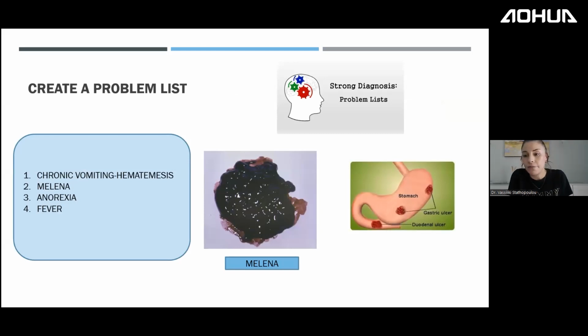Whenever you want to have a diagnosis, always create a differential problem list. And I have it in all the cases. These are cases that we have also uploaded to the Aohua YouTube channel, for those of you who haven't had the chance to watch them, for everyone to have access. We're going step by step in the diagnosis. The problem list in this patient was chronic vomiting and, during the last days, hematemesis, melena, anorexia, and fever.